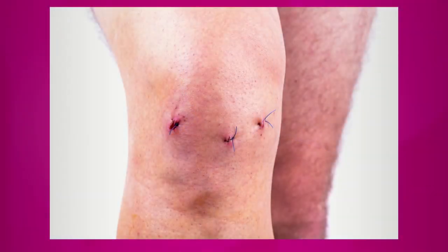Let's show that image one more time — look how fascinating that looks. Those are just three little holes, and that's basically how the arthroscopic surgery is done. No big deal.